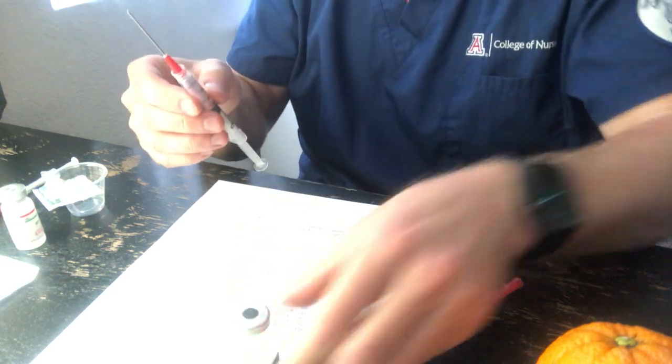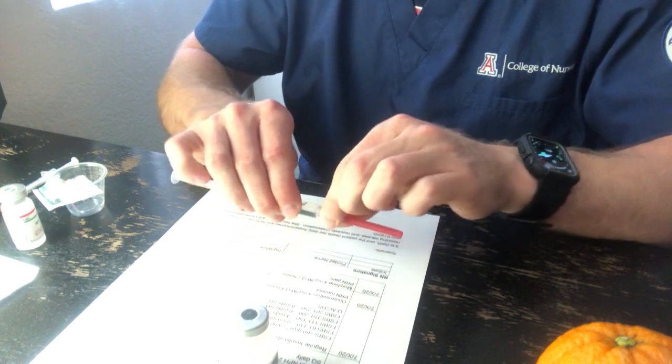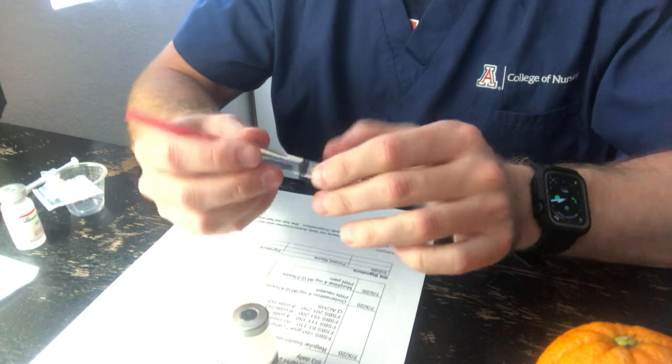I'm going to scoop, grab the base, click. I also need the 2 mLs in there.